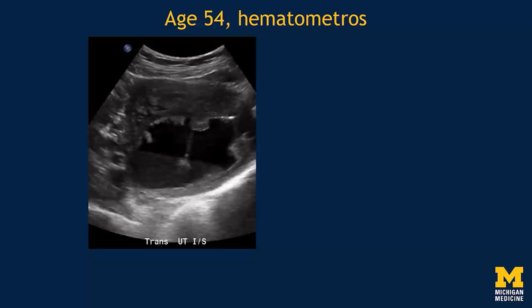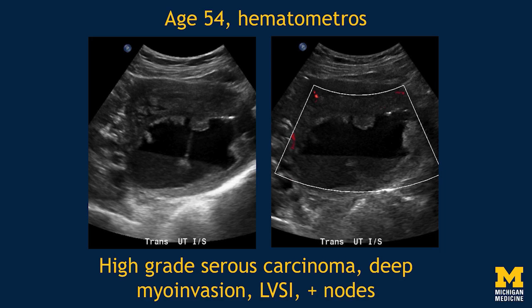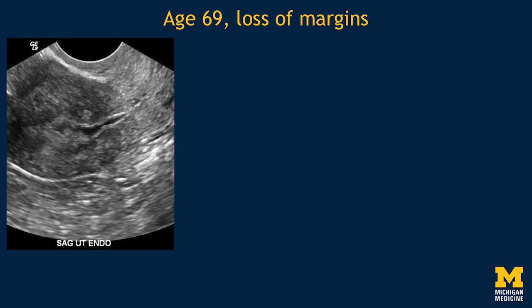Here's another concerning morphology — hematometros, particularly in the setting of irregular soft tissue lining the endometrial canal. Here we see a patient who has both areas of soft tissue studding the canal and a stalactite of blood hanging down into a pool of hemorrhagic material layering dependently within the endometrial canal. We were able to demonstrate some vascularity within this tissue. This was actually a multifocal high-grade serous carcinoma with deep myometrial invasion, lymphovascular space invasion, and positive nodes — again, that serous carcinoma type 2 can be really aggressive.